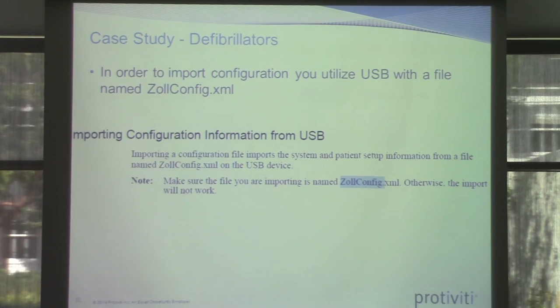If it's a Windows system, we search for XML files as soon as we get on the device. If it's a Linux-based system, we search for conf files, and then we just start looking through them and finding out what they do. It's a USB device. Yes. You can put any of your cool microcode on if you want. Yeah, but you have to name it the super secret name or it won't work.